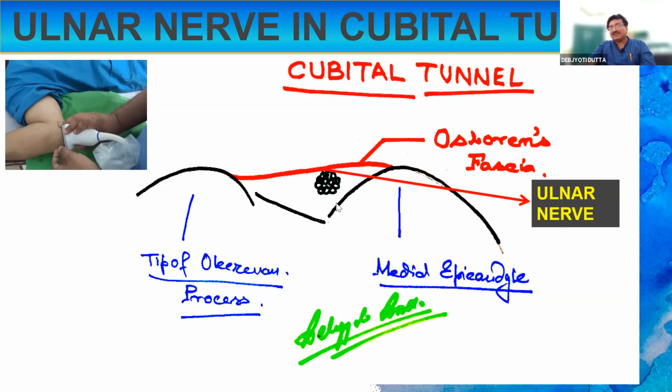And remember, in this area, this nerve usually appears hypoechoic. We all know that nerves sometimes appear honeycomb, sometimes hypoechoic, sometimes a little honeycomb plus hyperechoic, depending on how the surrounding structures are. If you see the median nerve at the proximal part, you will be able to see the nerve hyperechoic and honeycombed.